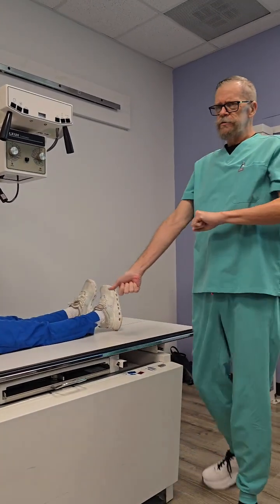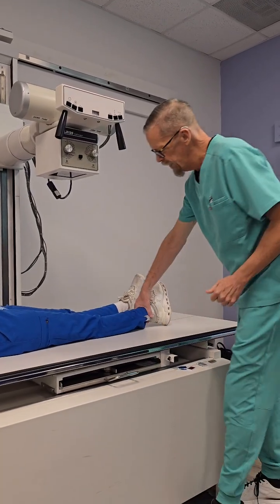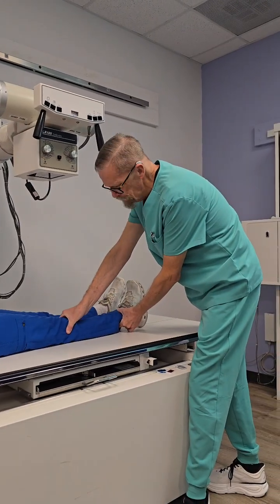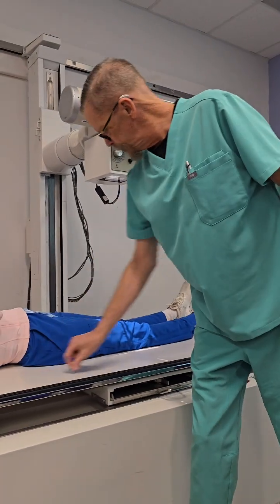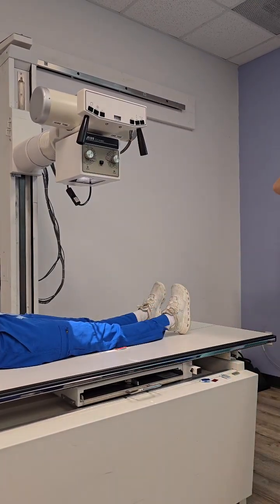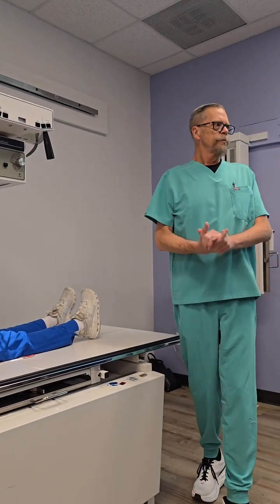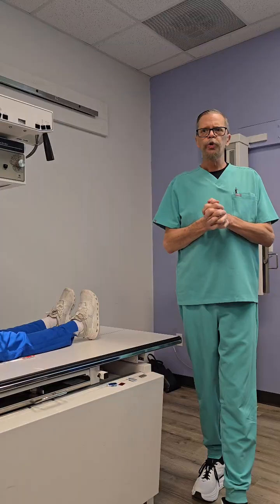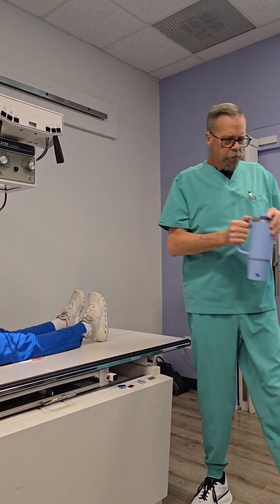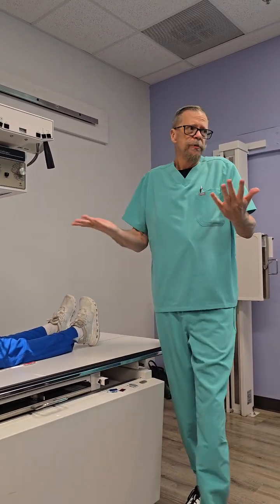Do I still leave it rotated 15 degrees? No — five degrees now. Now all we're looking for are the epicondyles parallel, so very little rotation. Don't forget to move your marker. And that is your AP distal femur. Pretty simple, right? No specific central ray location to remember. The rotation and ensuring that we get the entire femur is the biggest thing.